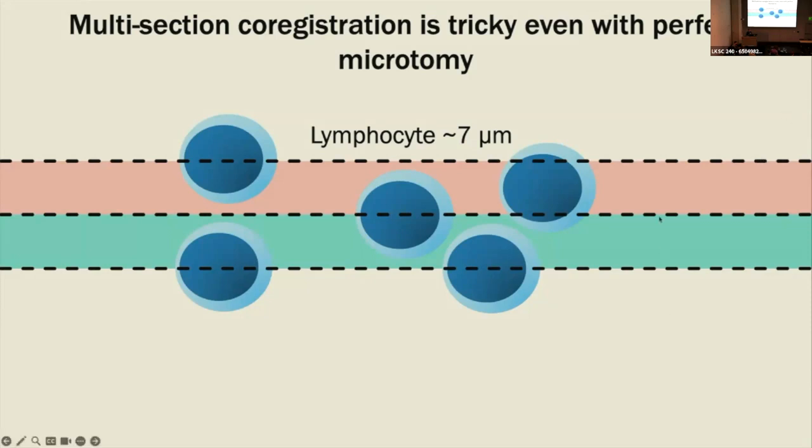For tissue blocks, because your assays have to be done on different physical sections of tissue, I don't know that that perfect analogy applies as much, because when you're doing whole body imaging, it's the same thing, whereas with tissue sections, it's different things. So even though they're pretty close, they're not going to line up with tissue sections. I don't know if that answers your question.